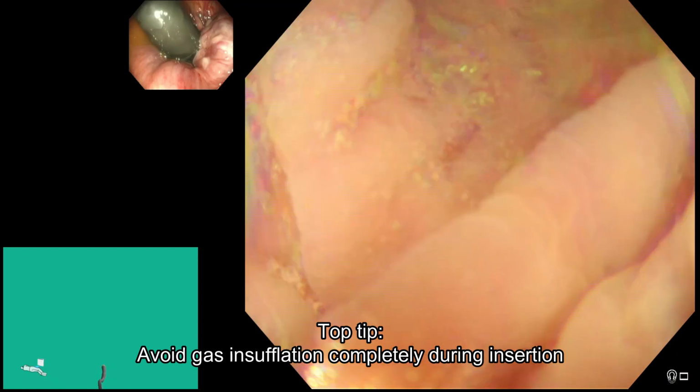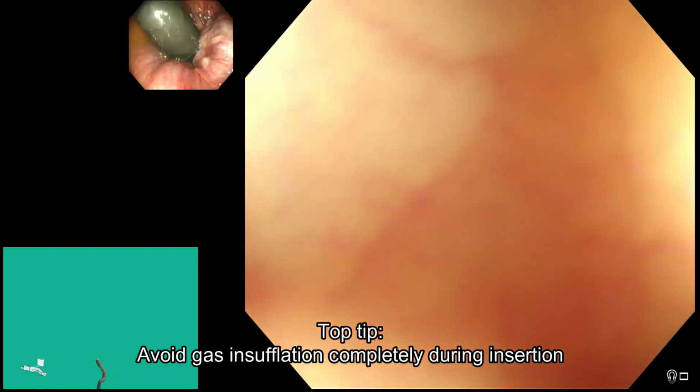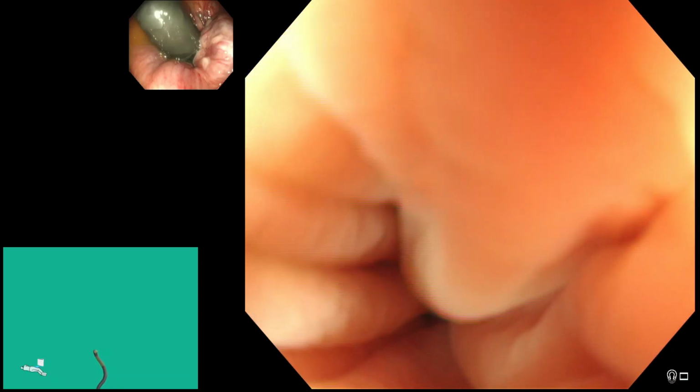Very important, not putting in gas at the same time. There are some people who turn off the carbon dioxide during water assisted insertion, and I personally think that's not necessary. I think I've got enough self-control to avoid putting carbon dioxide in.